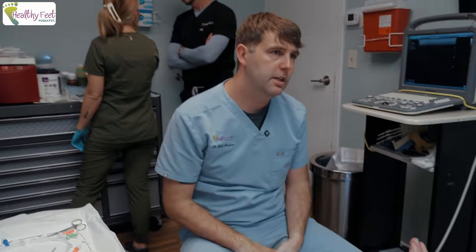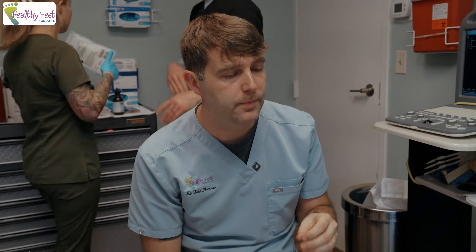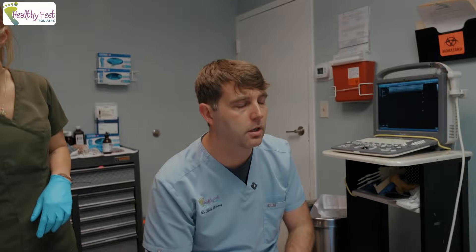Next week we'll have you back and we'll take the trial out regardless of how you feel. At that point we'll determine: did you get the relief you wanted? If you did, we'll schedule to put the permanent one in, which is pretty much the same thing we just did. If you don't get relief, we'll take it out and that's it — then we'll talk about maintenance medicinally if that's an option.